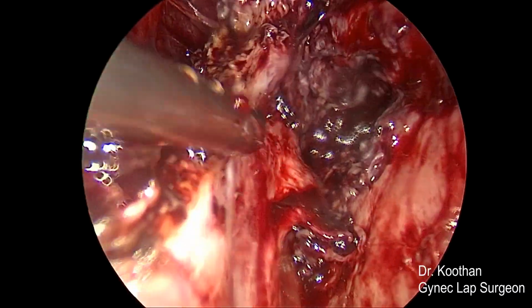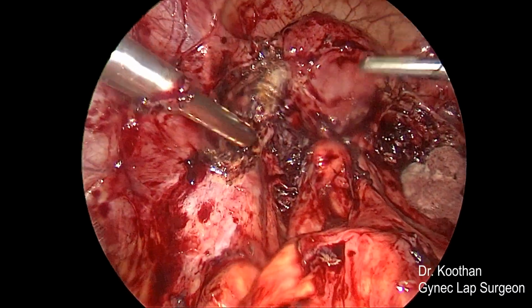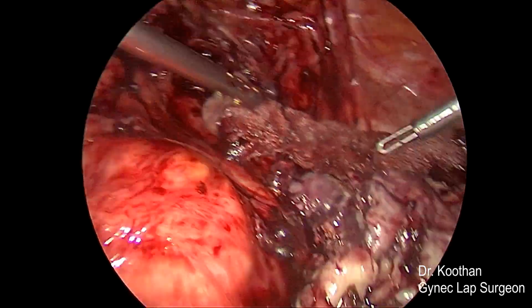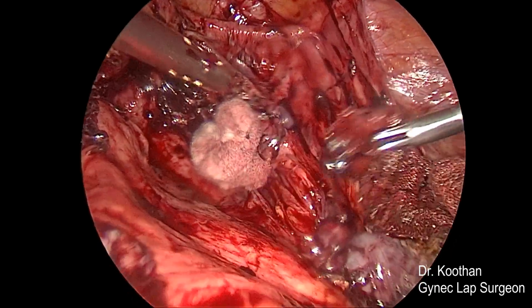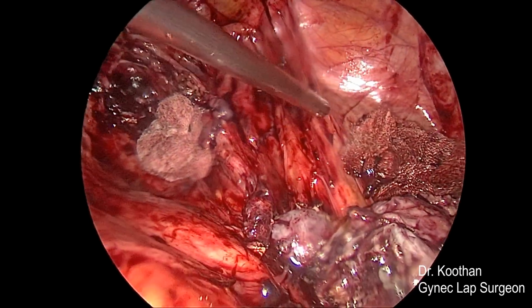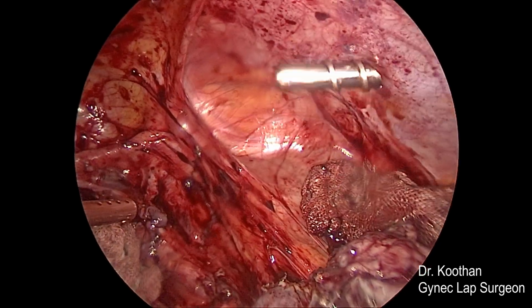You can appreciate the anatomy. So bilateral adnexal adhesions have been released. Bilateral tubectomy has been done. Now the only remaining adhesion is the rectum adherent to the posterior surface of the uterus, which has also been released, and the normal anatomy is completely restored.